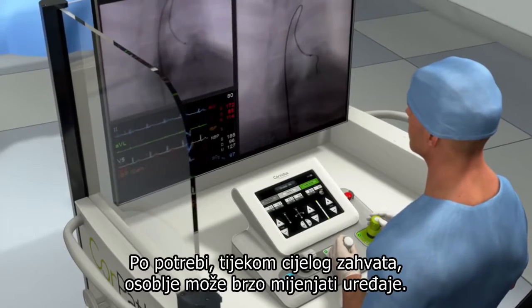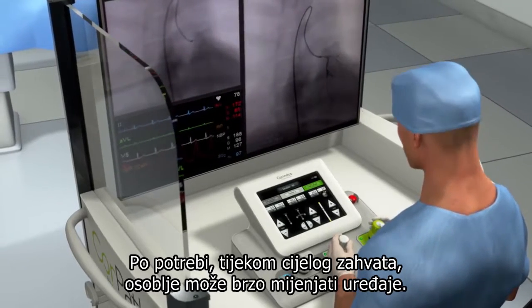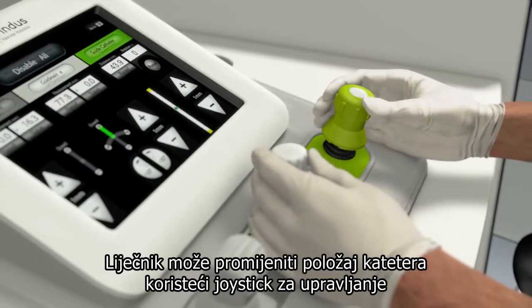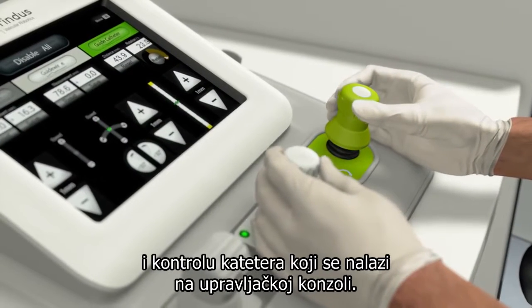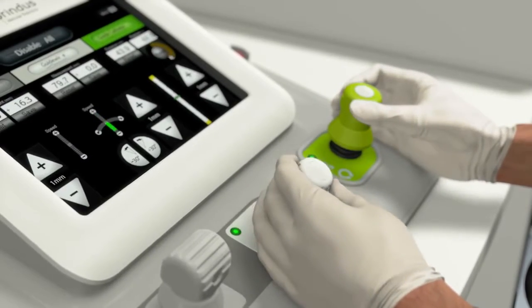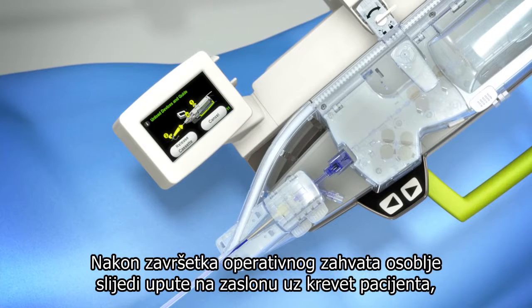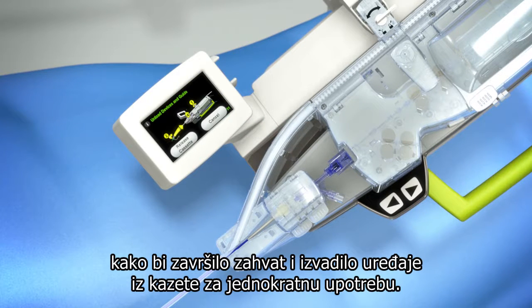As necessary, devices can be quickly exchanged by the scrub staff throughout the procedure. The physician can reposition the guide catheter using the guide catheter control joystick located on the control console. When the procedure is completed, the scrub staff follows the instructions on the bedside touchscreen to end the case by removing the devices from within the single-use cassette.